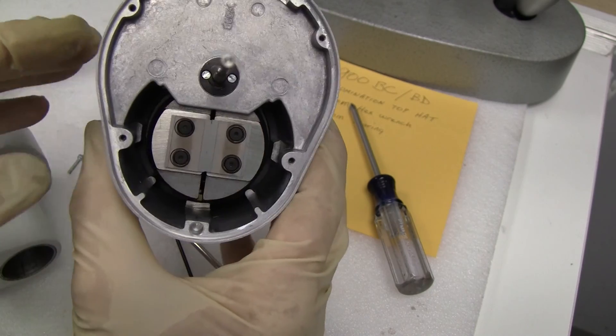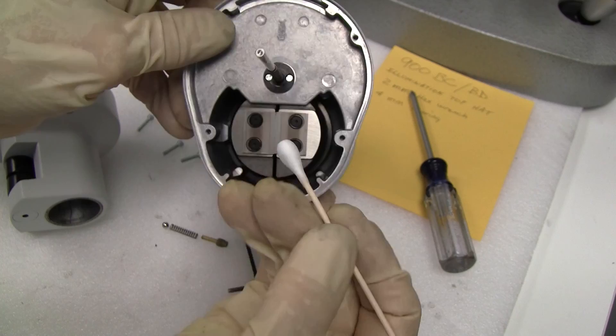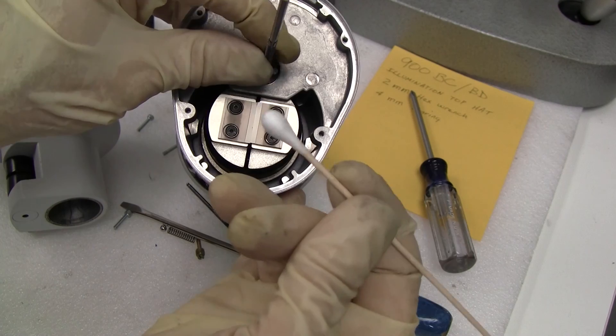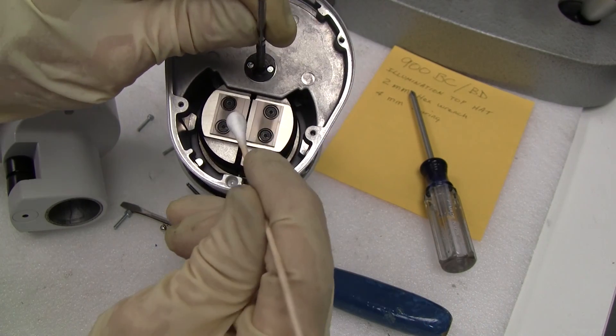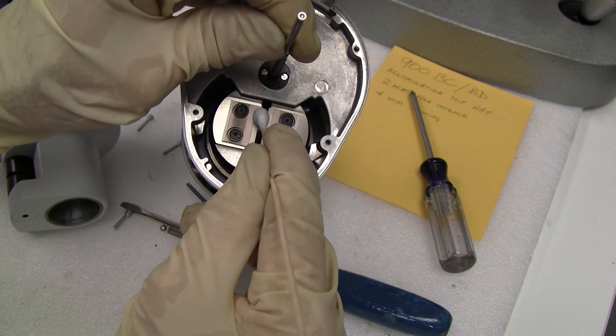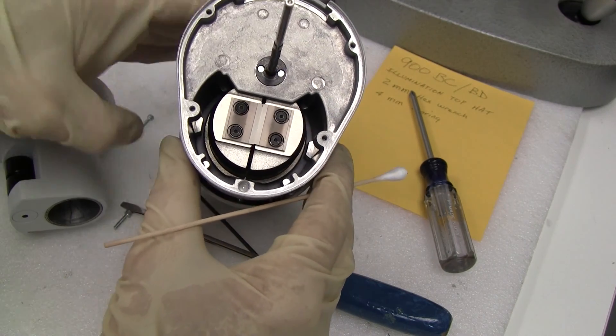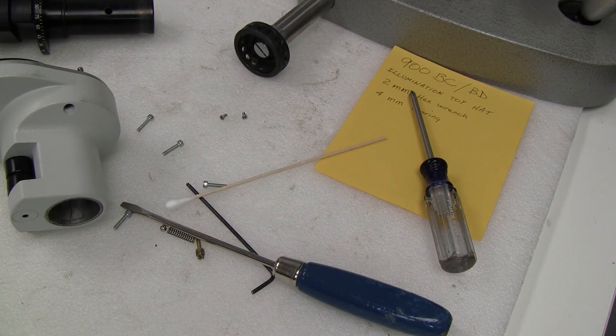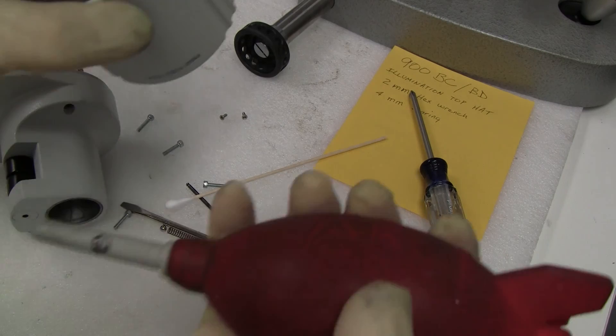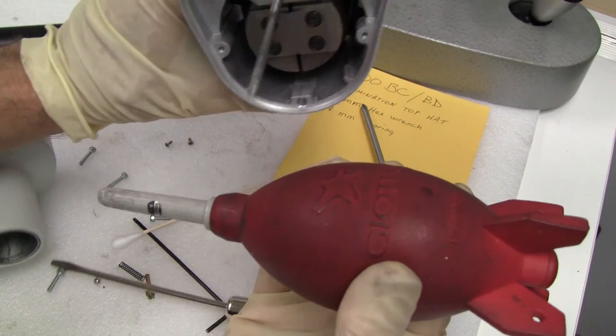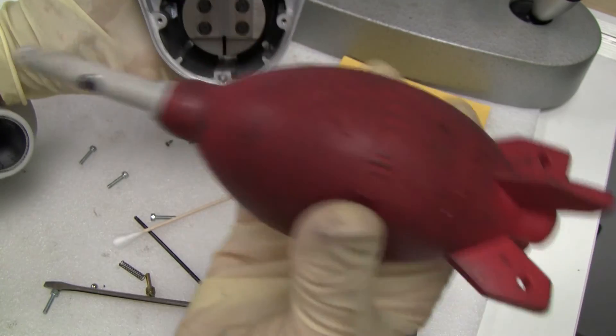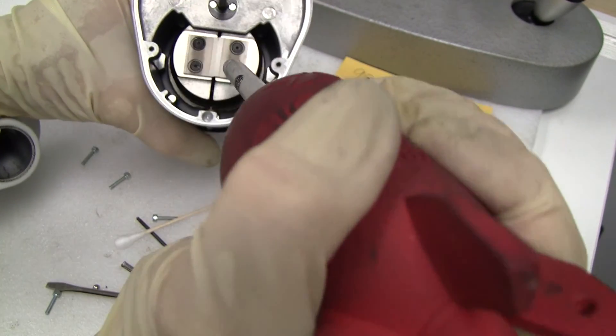If you need to clean the slits, you can get a cotton swab with some acetone and clean the slits. And be sure to blow it out with your hurricane blower.